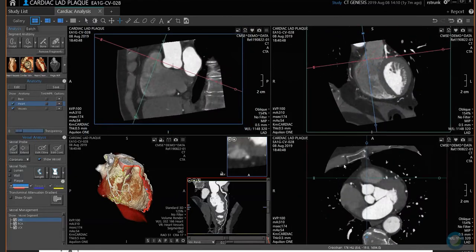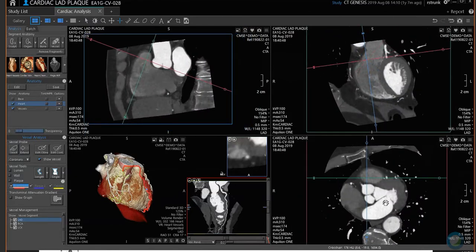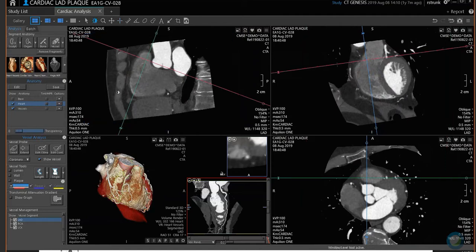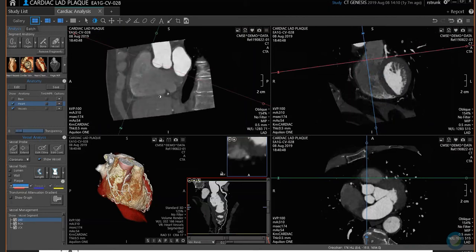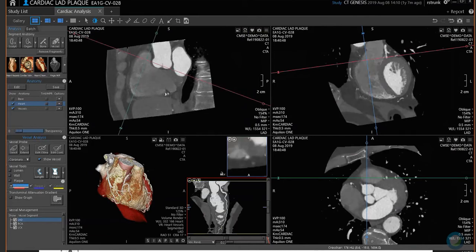The key on your main toolbar across the top — this is your left mouse function. The first one is the window level. If you do need to window level it, you just click on there and then move your left mouse any way that you need.